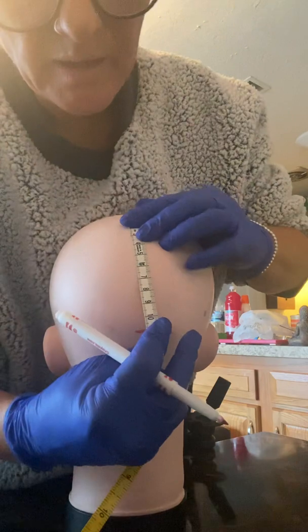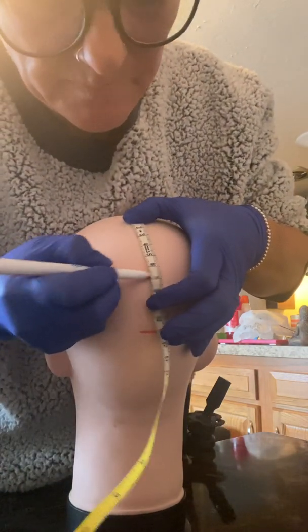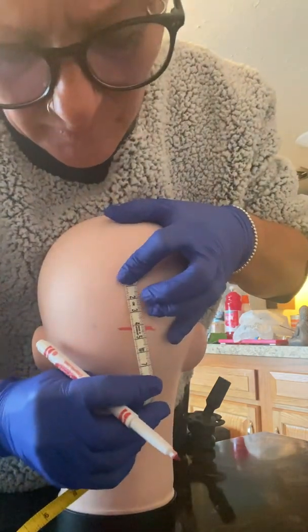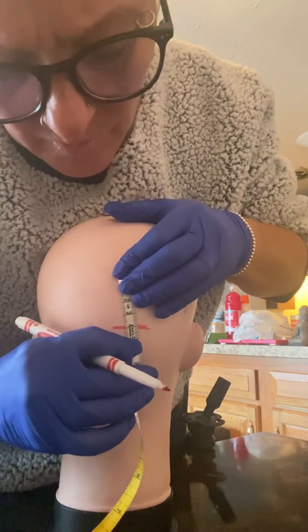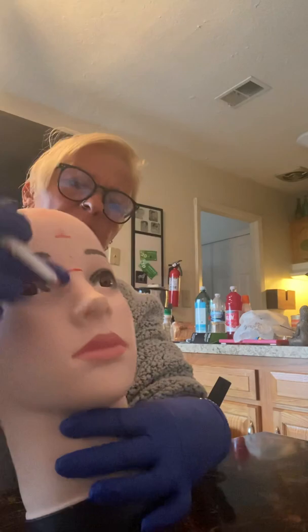And then one more 6.6 for OZ, and then 10% which should be about 3.3 back to the inion. So to recap: 10%, 20%, 20%, 20%, 20%, and 10% along the nasion-to-inion line.